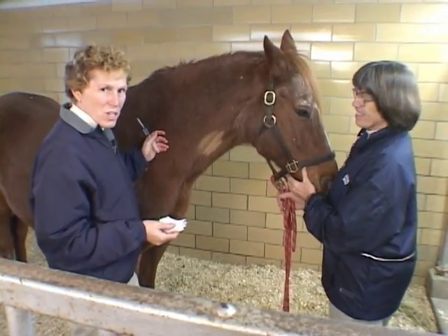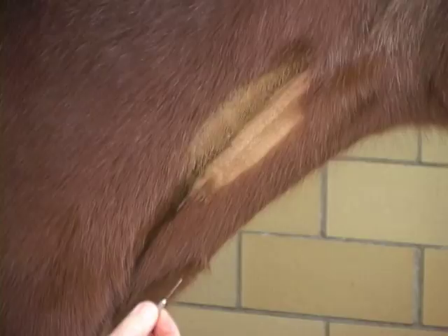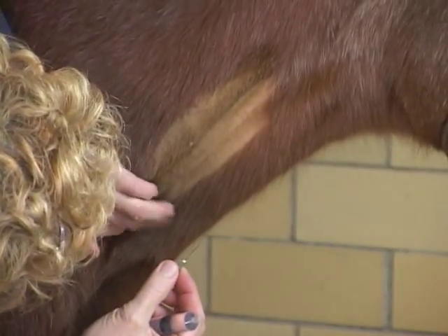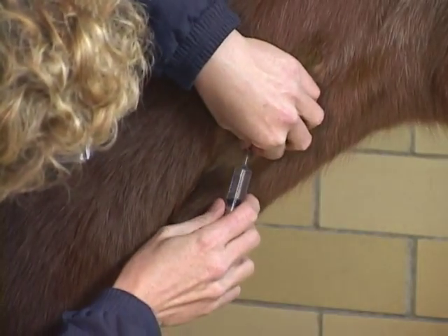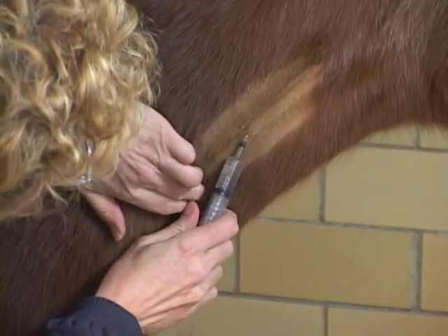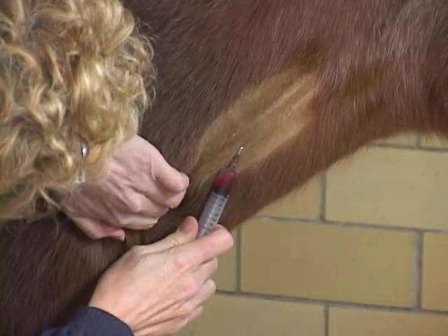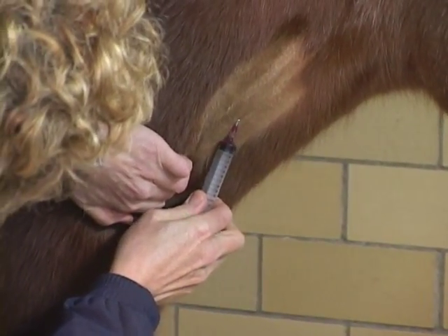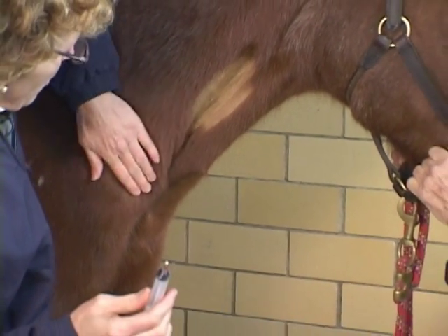Now we'd like to show a low-volume intravenous injection. We've moved Red around to the clipped side so you can see real well. Wiping it off with an alcohol wipe. I like to put my needle in not attached to my syringe — that's an old practitioner habit, a bad habit. You can see that vein real well where I've popped it up. I'm going to pop right into the vein and you can see the flashback. I'm going to attach my needle to my syringe and flash back into the syringe. My rule is that every time that horse moves, I need to flash back. We were using a 22-gauge needle there.